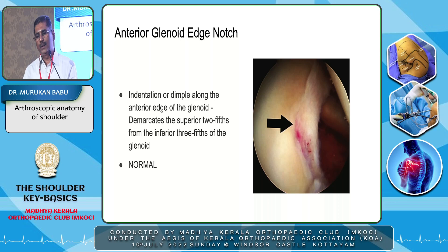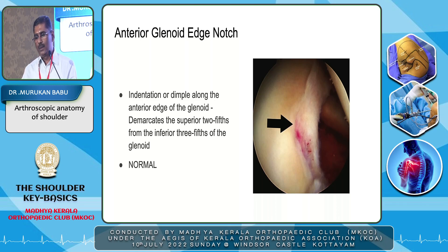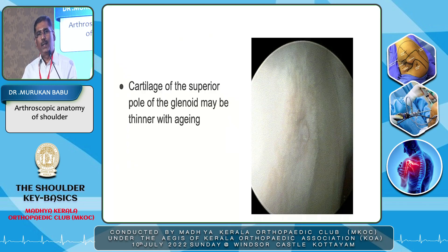Another variation is the anterior glenoid edge notch — an indentation or dimple along the anterior edge of the glenoid that demarcates the superior two-fifths from the inferior three-fifths of the glenoid, which is also normal. Sometimes in the superior part the cartilage may be thinner, related to aging. These are the anatomical variations in the fourth position — the glenoid articular surface.